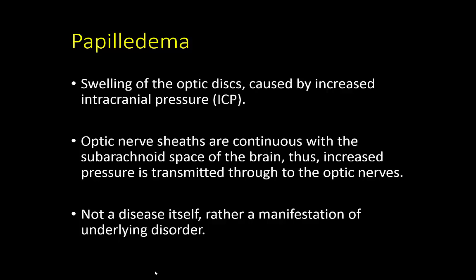Now, of the abnormalities that a neurology resident must recognize, the most important by far is papilledema. Indeed, this is the ACGME milestone that's required of all neurology residents, the ability to recognize papilledema on fundoscopy. What is papilledema? It's swelling of the optic disc, but specifically caused by increased intracranial pressure.